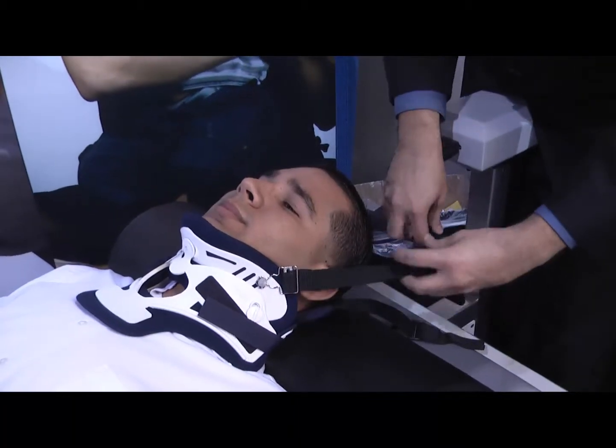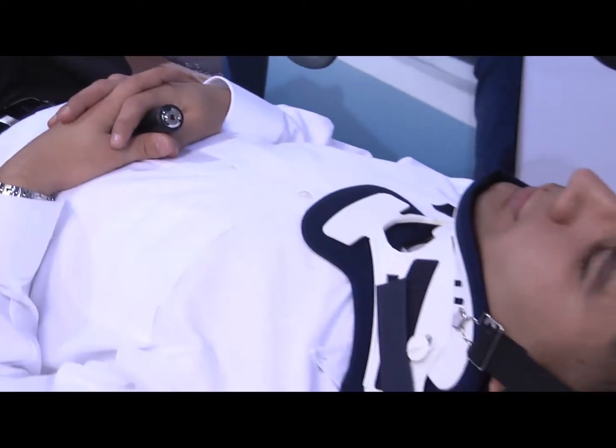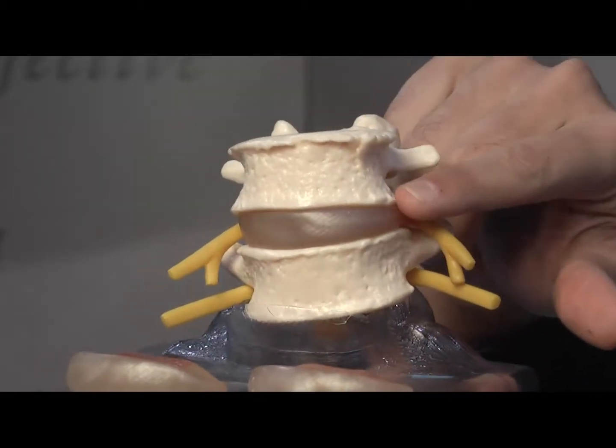The treatment consists of 20 sessions. Each session is about 30 to 45 minutes. This is a curative method — it's not a temporary relief. It actually cures the disc. Once it goes back into its place and it heals the rupture, it stays in.